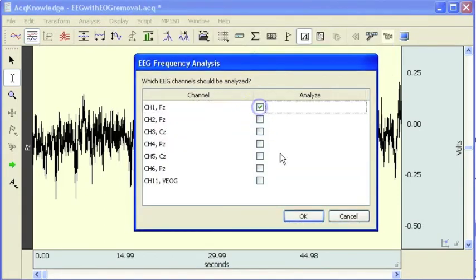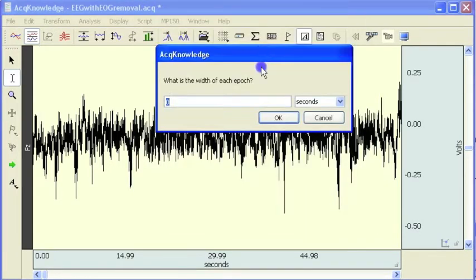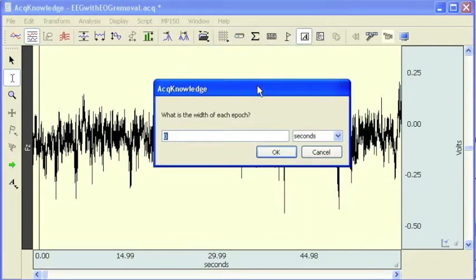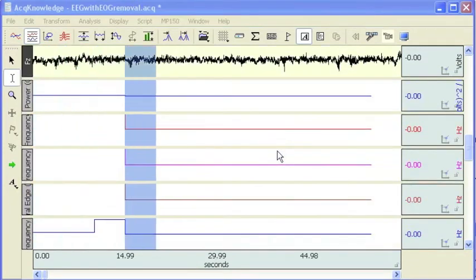We use FZ again. Use a 5 second width, hit OK.